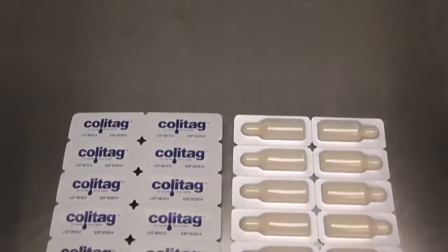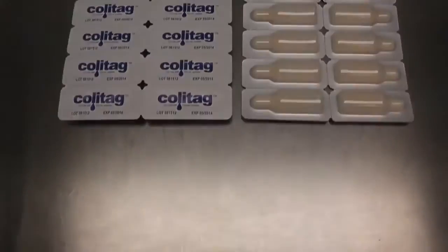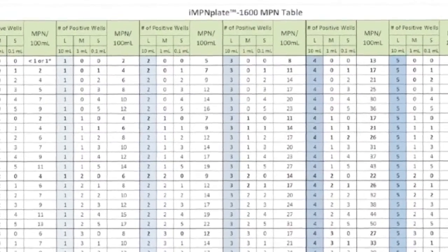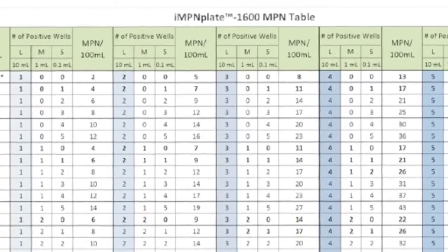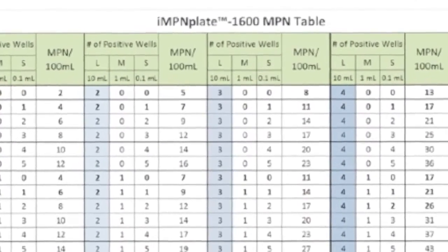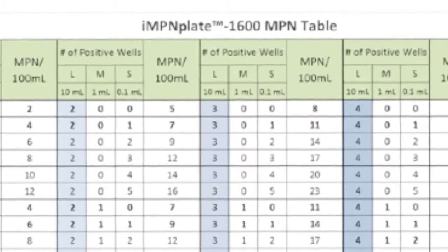The plate is designed for use with Colitag and modified Cola tag methods, and final results can be recorded as the most probable number of coliforms and E. coli per 100 mL water sample.